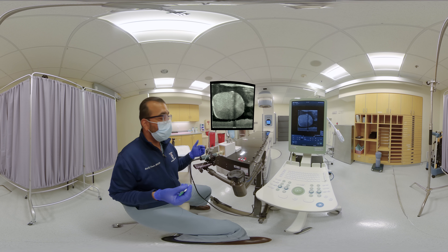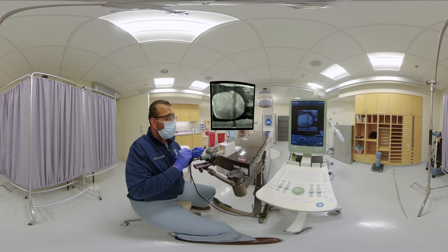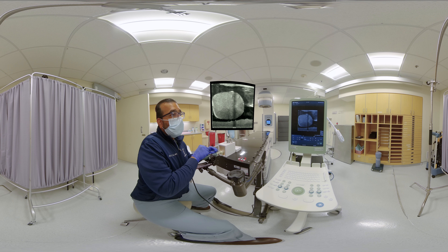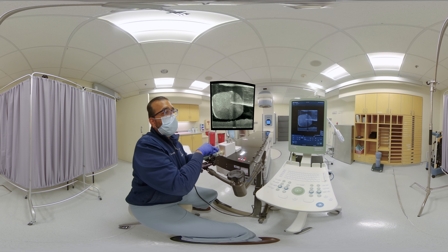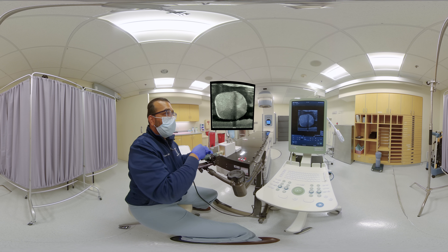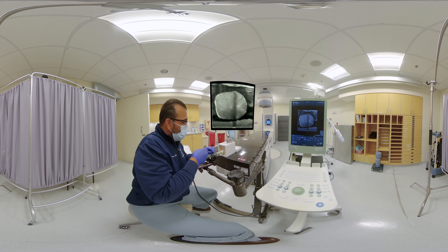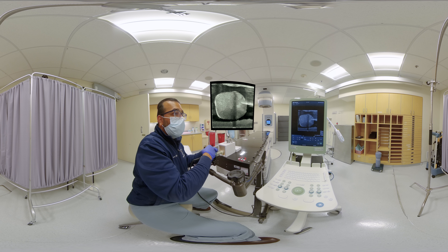You'll follow the imaginary line down the middle of the ultrasound buttons. If we have followed the imaginary line straight and correctly, then the entire needle will show in the sagittal plane parallel to the ultrasound probe. Our needle here is just inferior to the apex. You can advance the needle into the patient to the base in this plane. My angle is pointing upper anterior, but this is okay for fiducial purposes. You'll deploy your fiducial and then retract the needle. Without moving the ultrasound, a cheat to put it at the apex is to follow the same exact pathway to place an apex fiducial.